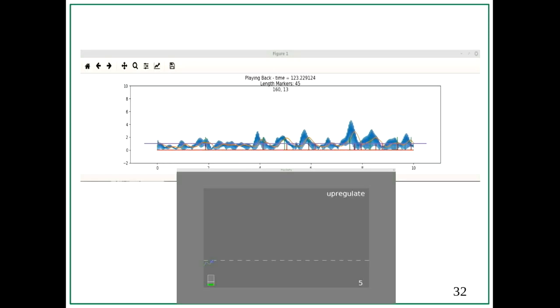And then the top figure is what you show on the real-time computer, and the bottom figure is what you see then on the stimulation computer. And in this way, the first neurofeedback setups are done.